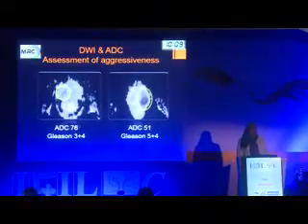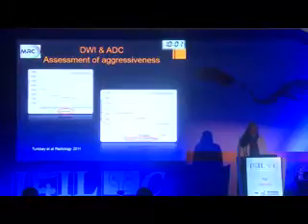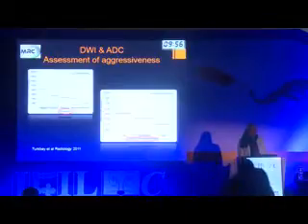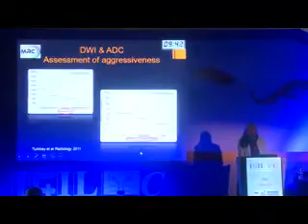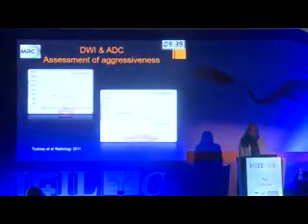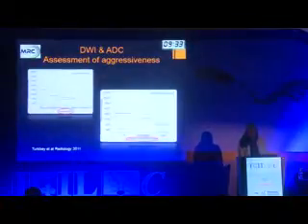So the darker the signal, the more aggressive the tumor, and this was correlated with histopathological data. This was proved in the literature in a correlation of ADC values with the Gleason score, and it again proved that the lowest ADC value, which is numerical data we can interpret from this map, is correlated with the higher Gleason score. Also, this is very crucial for clinical assessment because we can assess the severity of the disease and its aggressiveness. With a lower ADC value, the tumor is more aggressive.